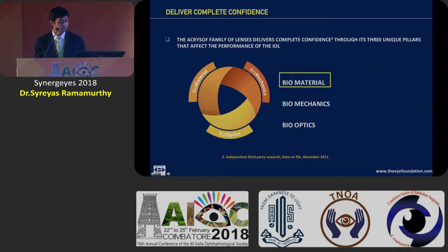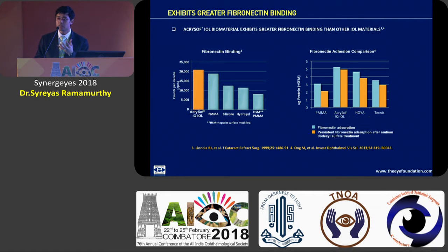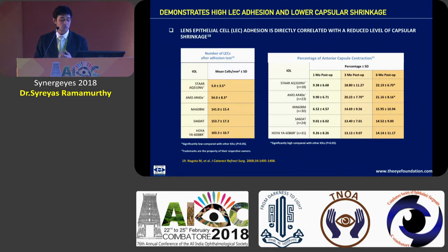Yeah, thank you. If you look at the Acrysof lenses, most of you know the good qualities or the pillars which the Acrysof IQ lens has to offer, and they really can't be discounted. Most importantly being the biomaterial of the lens, which has a greater fibronectin binding capacity, which really helps it to have stability and adherence to the posterior capsule. Subsequent to that, the amount of inflammation induced is also quite less, and with greater adhesion, lens epithelial cell migration is reduced, leading to reduced rates of PCO as well as capsular shrinkage.